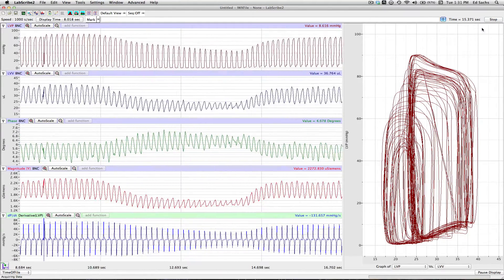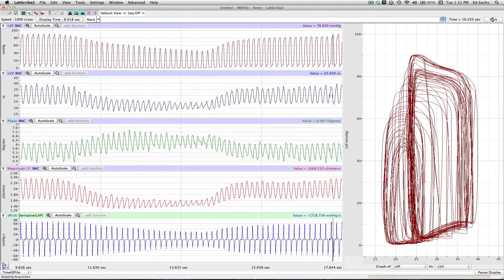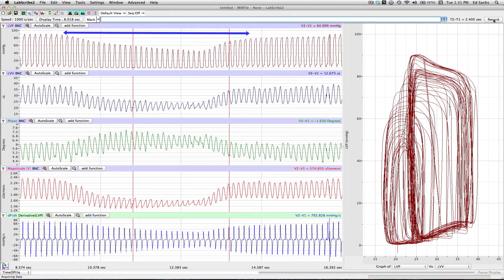I hit stop. You can see our occlusion data and now we're ready to analyze.